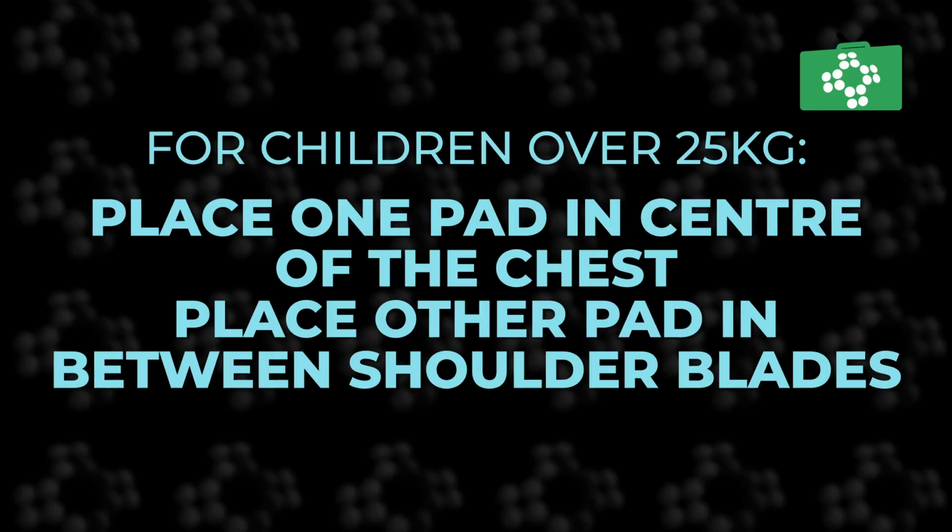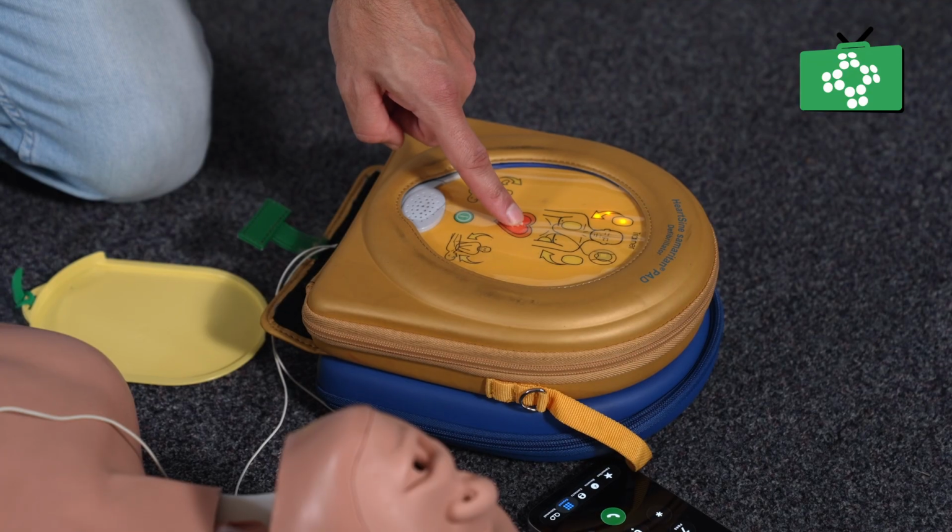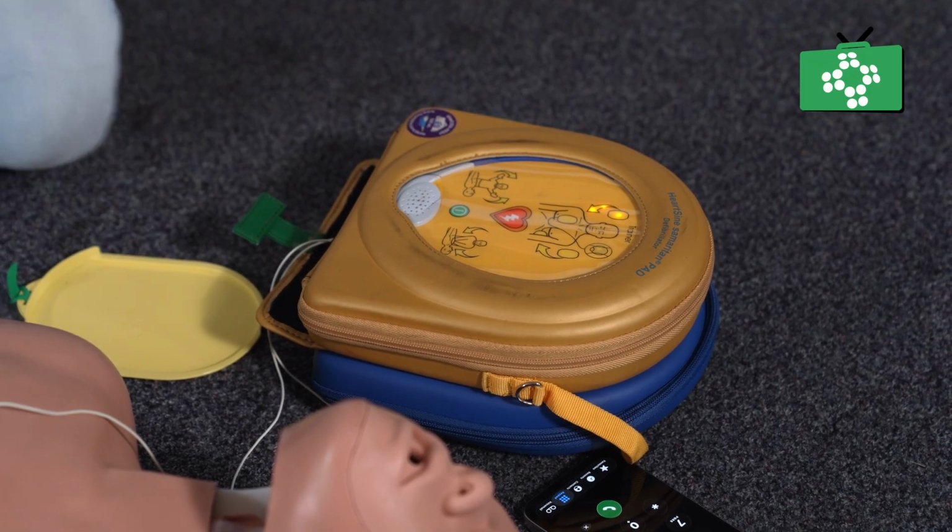For children over roughly 25 kilos, place 1 pad in the center of the chest. Place the other pad on the back between the shoulder blades. When the AED says stand clear, make sure no one is touching the child. If a shock is advised, ensure everyone stays clear while it's delivered.